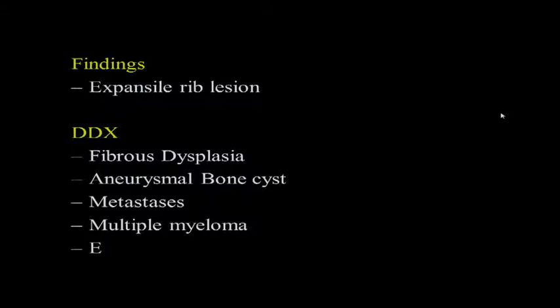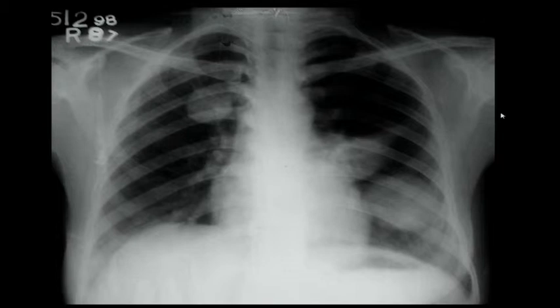Very good. This is yet another patient. Sylvia, it's yours. It's a companion case. It may not be the same case. Are these lesions in the chest wall or are these lesions within the lung? You have to pick one. In the lung. Very good.